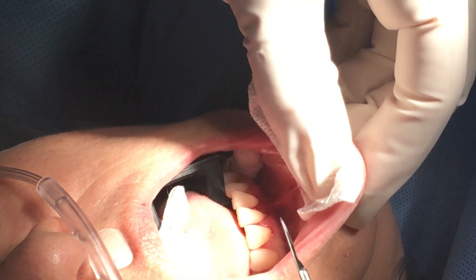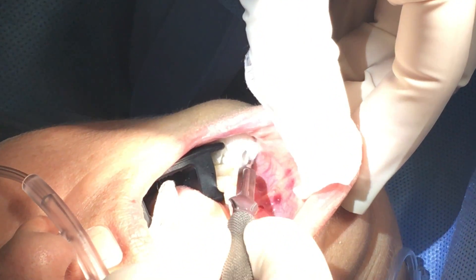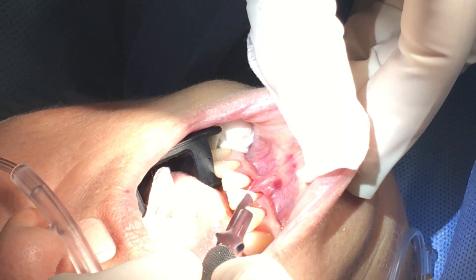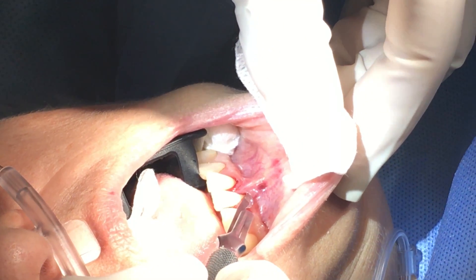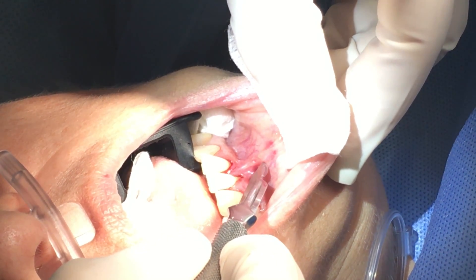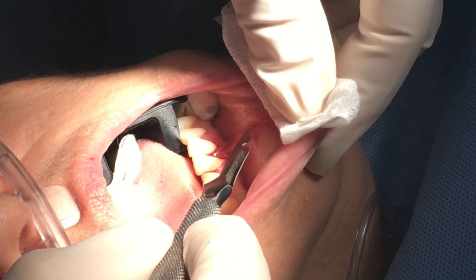Okay, so now we're going to begin our lip switch incision. I measure the amount of recession — it should be about one and a half to two times that, so we're about here, or to the extent of the frenum.